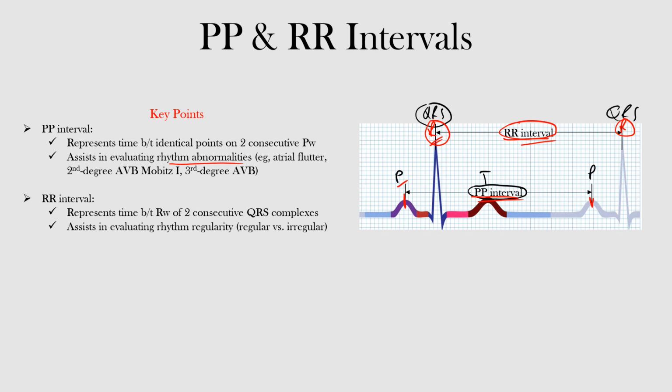Well, that's the end of this lecture. We discussed the P to P and R to R intervals, specifically what they represent and how they can be useful when interpreting EKGs.